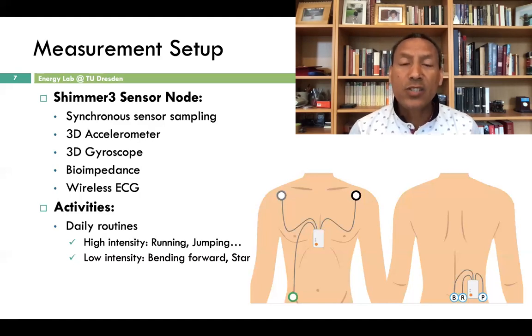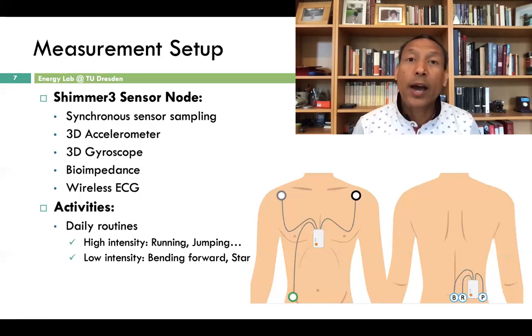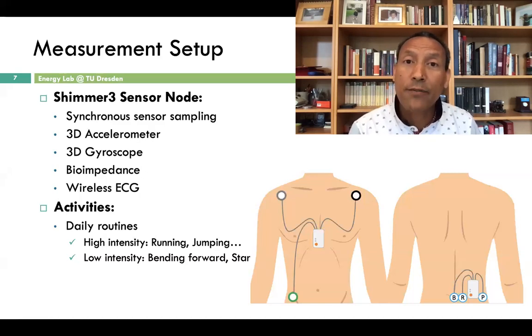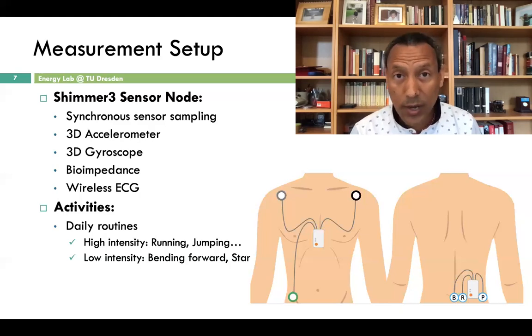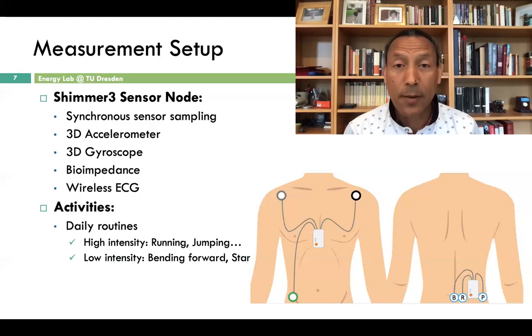Now, it is difficult to distinguish between the motion affecting the electrode from outside as well as from inside. We are interested only in the outside because the outside is the one which affects the electrodes. The one inside is not responsible for the undesirable movement of the electrodes.